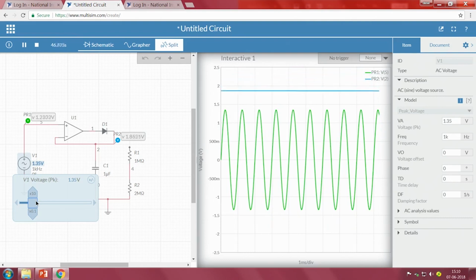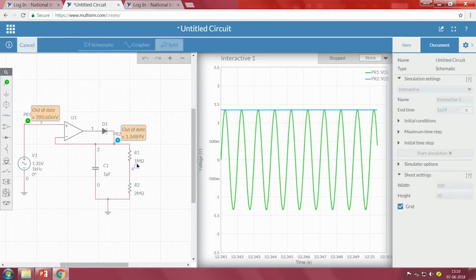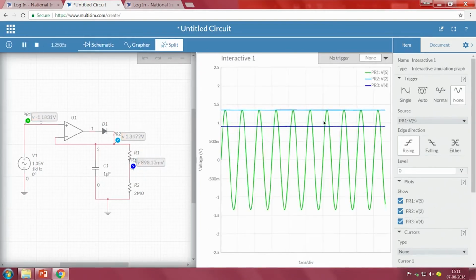Now, what is our other purpose? We have to see whether it is providing the threshold of our requirement or not. So, in order to understand that, what do we do? We will connect this R1 resistor and take another output voltage, connecting at this point. This particular terminal I am not interested in. So, let me run, and even if it is there, no problem for us. So, this indicates our output voltage at this particular point, and the violet color indicates the threshold, that means the voltage at the junction or node point of both the resistors, 1 mega and 2 mega.